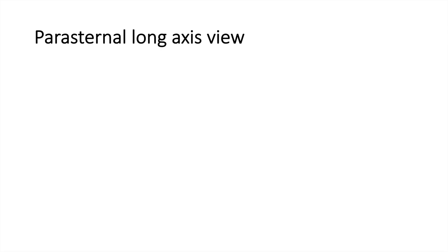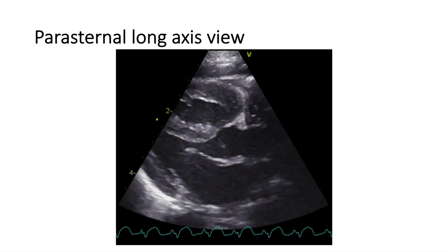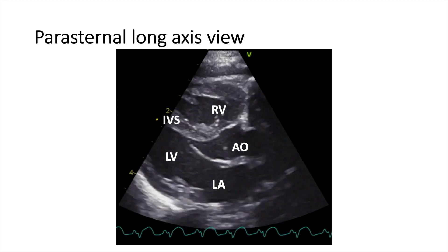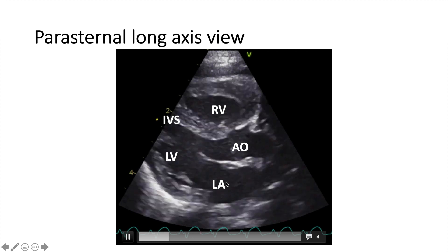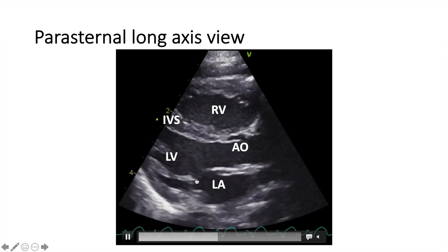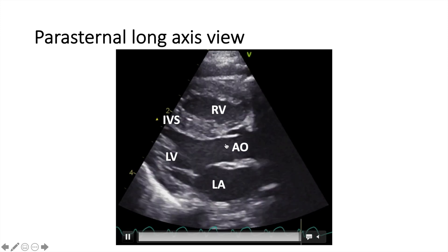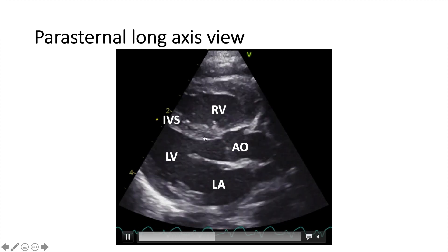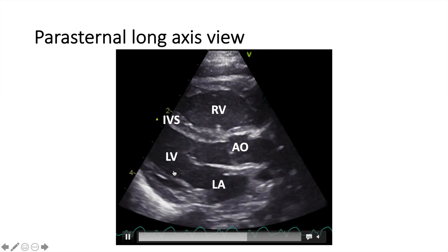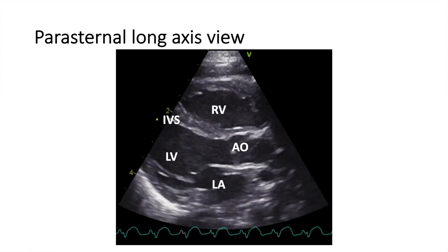Now let's move to the other view, which is called the parasternal long axis view. This is how it looks. I'm just going to put the labels on these chambers — you can see the LA here at the bottom and LV here. The blood will flow from the LA to the LV and then out of the aorta through the aortic root here. On top, you can see the RV and there is the interventricular septum in between the RV and the LV. This is a normal parasternal long axis view of a neonate.